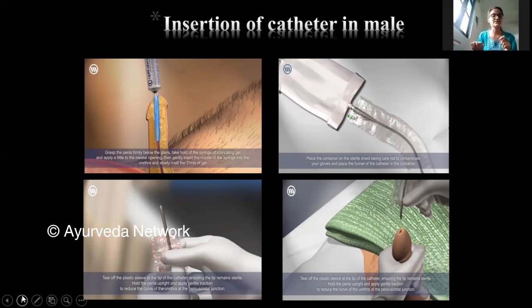You have to make the entire area sterile. So you will use betadine, and in a circular motion, from the meatus up to the base of the penis, you clean it first. And after that, you insert the lubricating jelly over the meatus and the urethra.